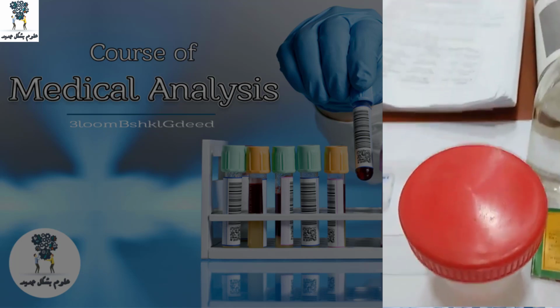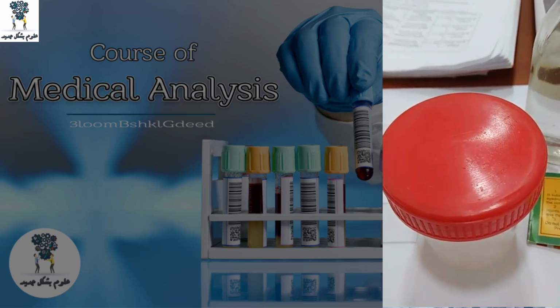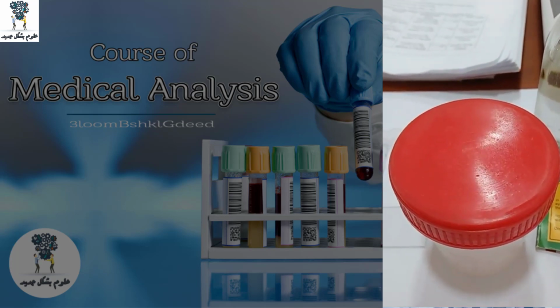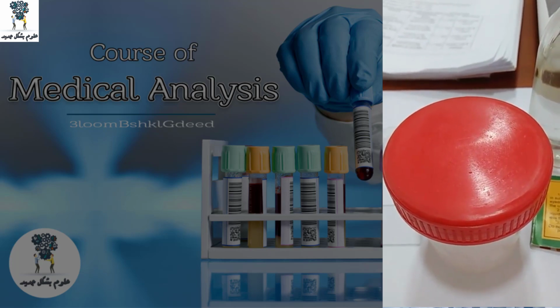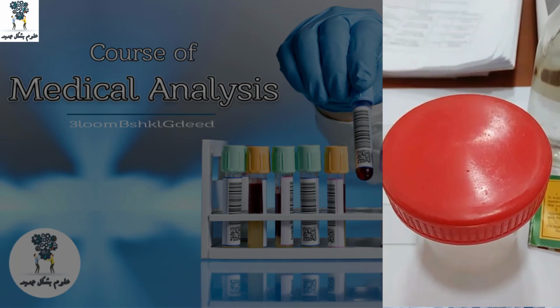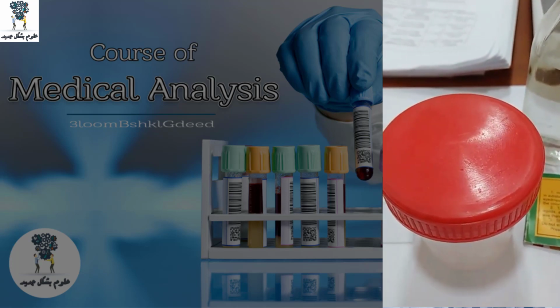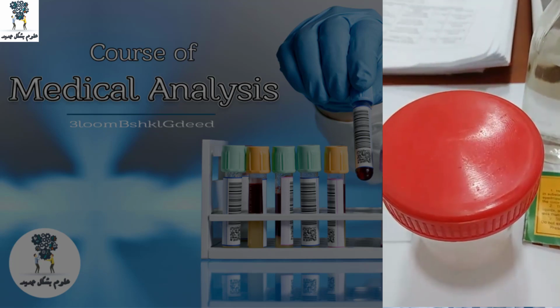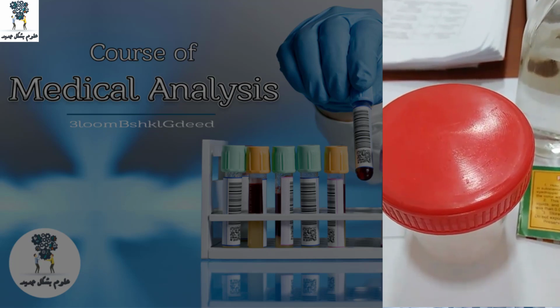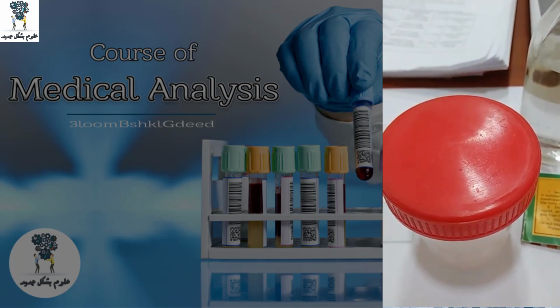And then we check the volume. What about volume? Normal is 1.5 milliliters. Around 1.5 milliliters may be accepted, but less than 1.5 milliliters is not good, and we will say in the report hypospermia.